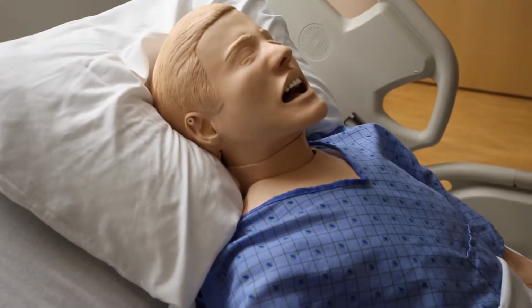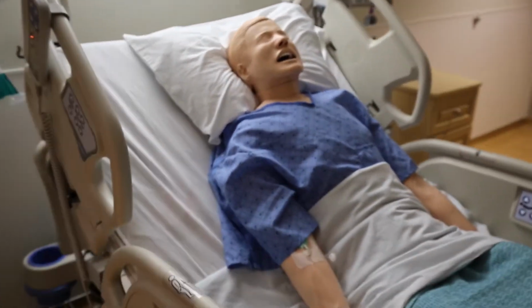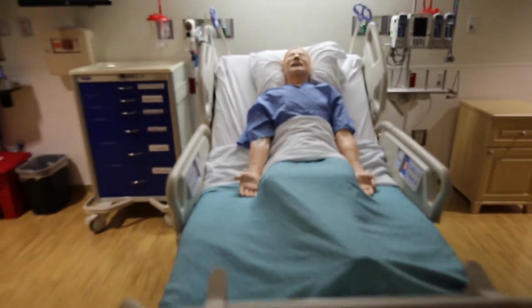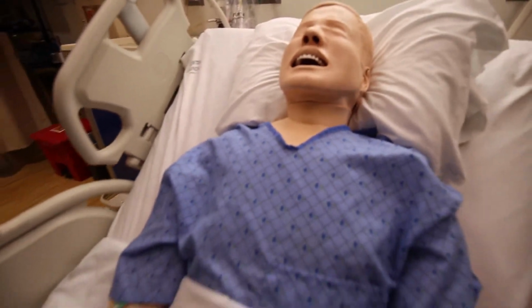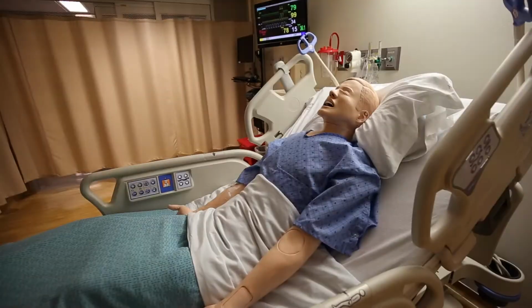This is the Laerdal ALS simulator, a wireless medium fidelity adult patient simulator. Certain functions on the mannequin can be controlled and operated by using a sim pad. Assessing how your patient is doing with a visual assessment can be difficult due to the fact that the mannequin does not move and does not have any facial expression.